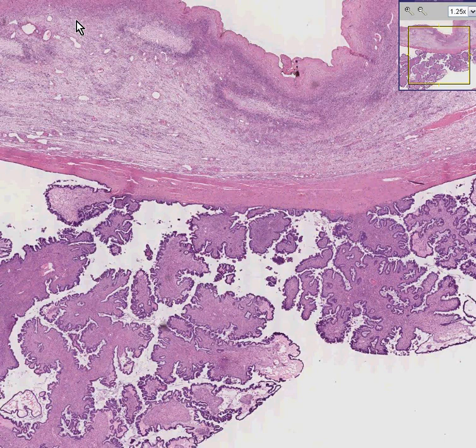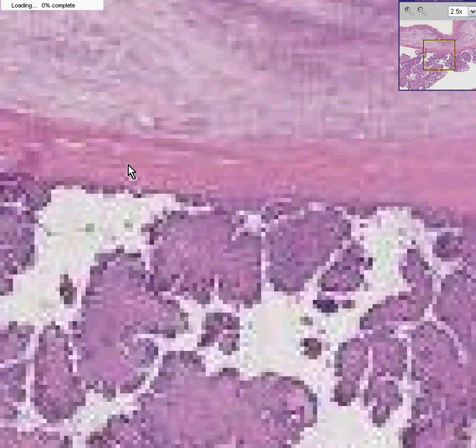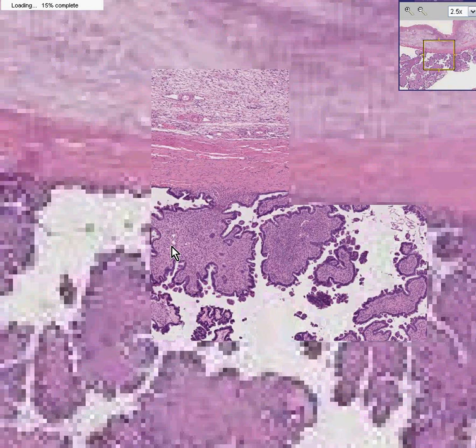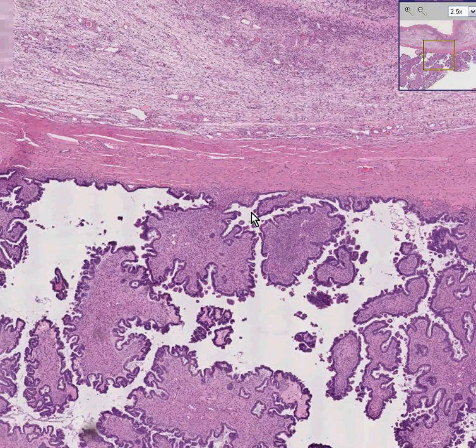Here is another ovary — another ovarian tumor. This looks like a sort of normal ovarian stroma. Here is the tumor involved. Notice it has an overall papillary configuration. Notice also it is glandular, it has surface epithelium, and it is attached to this cystic area. This could very easily have been called a serous papillary cystic tumor.